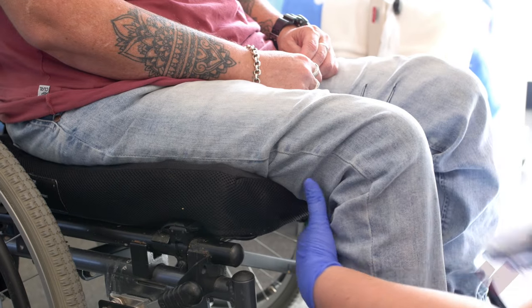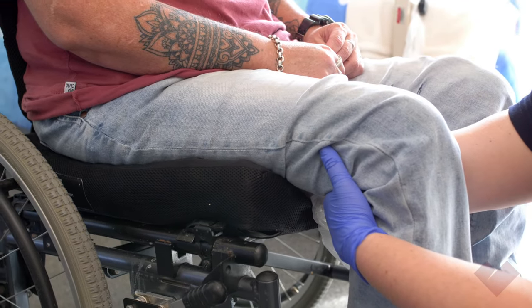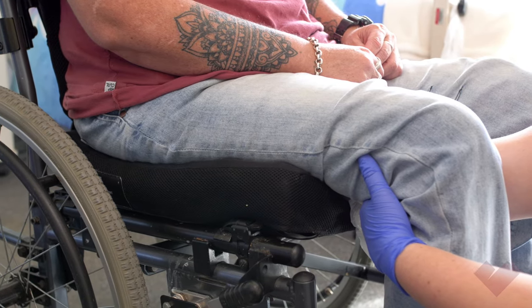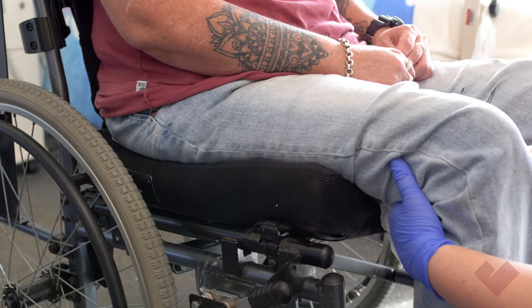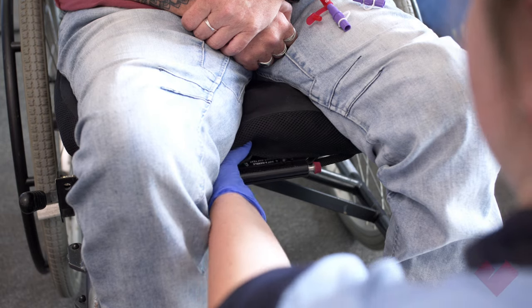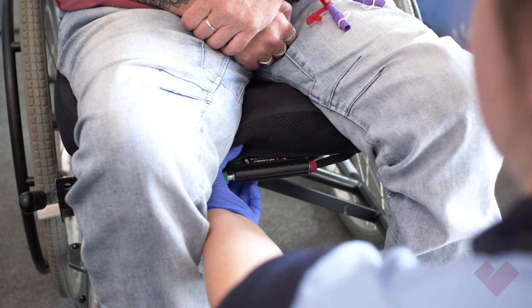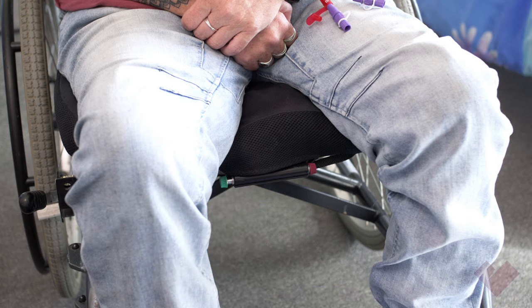Repeat the same process on the opposite side to ensure the person is evenly supported. Make sure the ischial tuberosity does not touch the chair. When the person is sitting with the correct posture, slide the isoflow memory control unit to your left to lock the airflow and maintain the person's position.